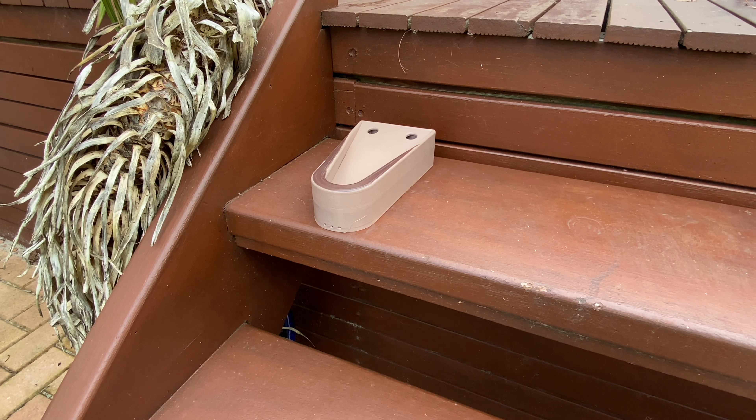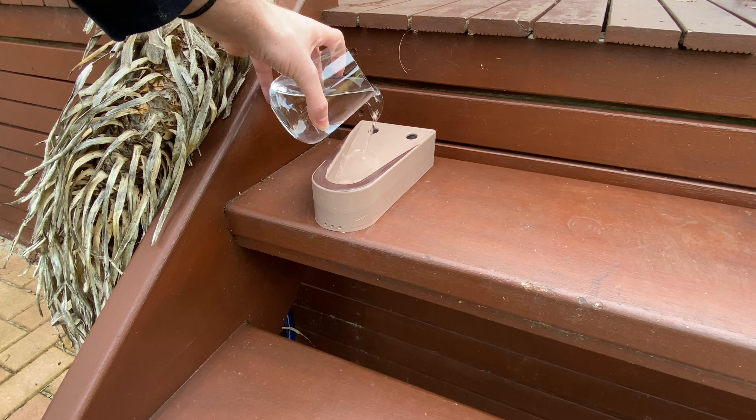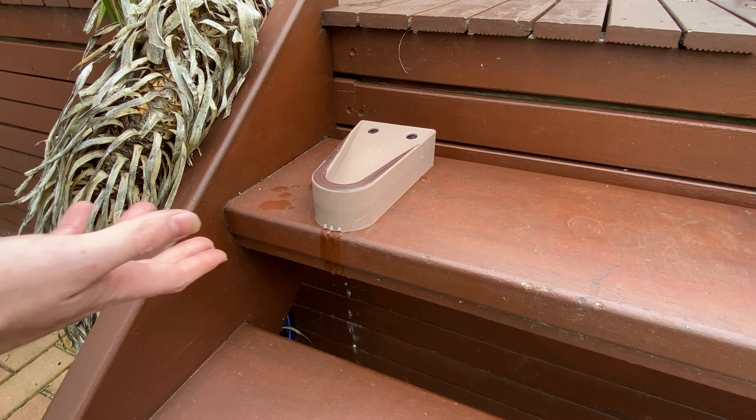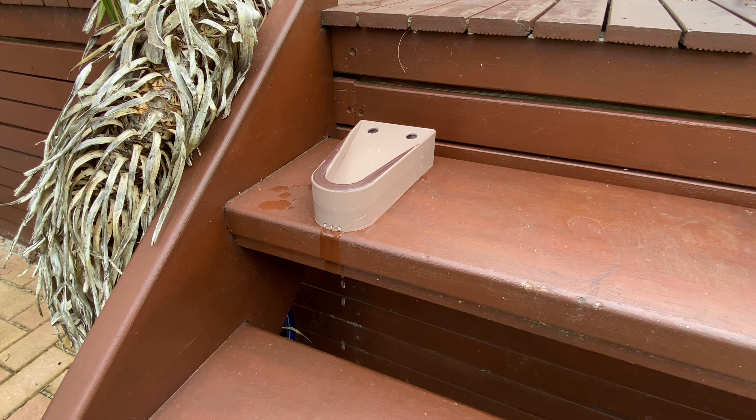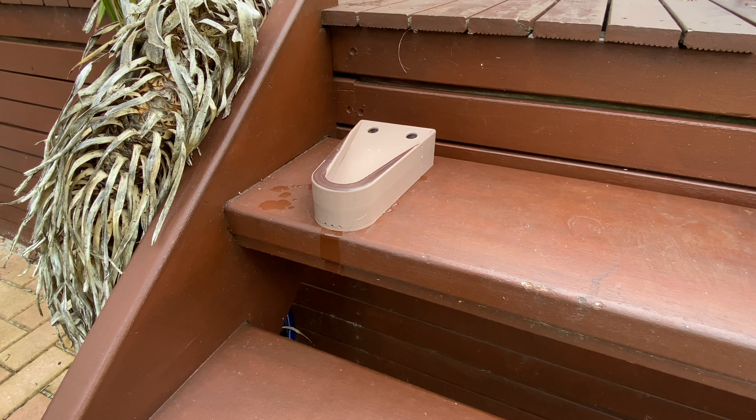Being a product for an outdoor setting, it's designed to combat the fact that there is water and slipperiness outside. In order for the product to deal with this, if there's water that does go into it, there are holes on the front that act as a drainage system to ensure it never fills with water. The holes on top are designed so that you can simply pull the ramp up and back out to undo the screws and remove the product.